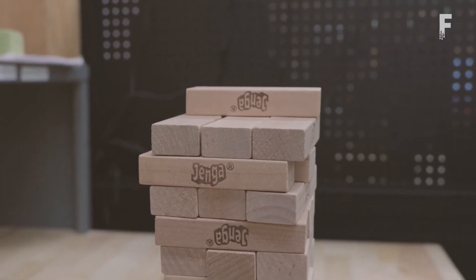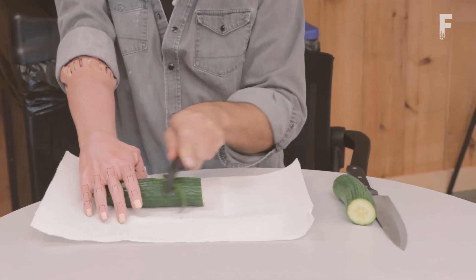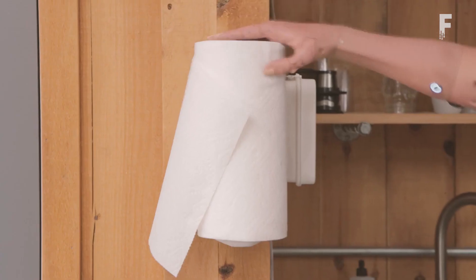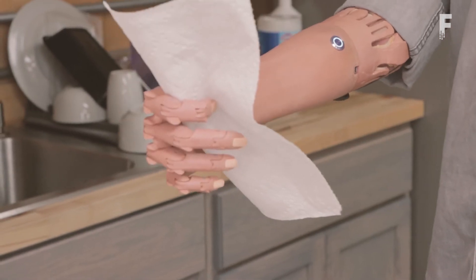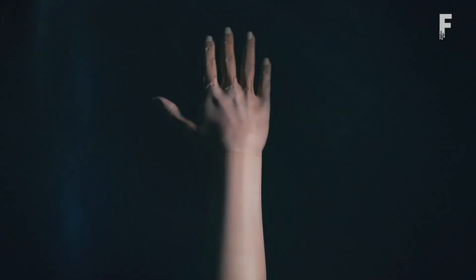Most exciting is how the prosthesis is able to actually emulate the workings of a human hand through a closed-loop feedback system, employing vibrations to allow the user to detect and adjust the force they are implementing. The use of an AI training module further improves this feature, allowing each prosthesis to become more and more in tune with the individual controlling it.